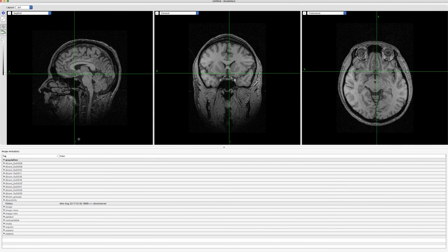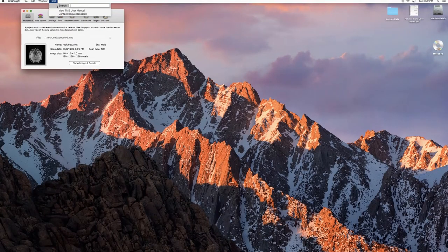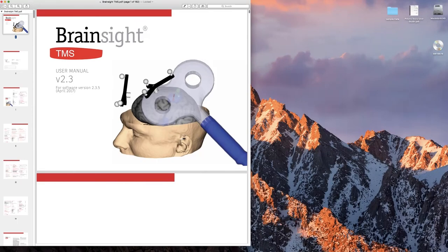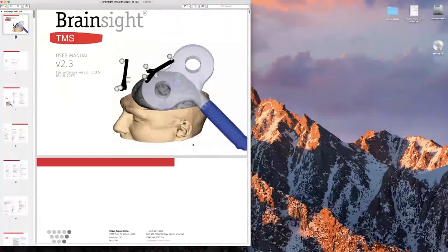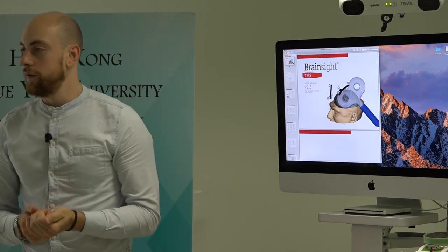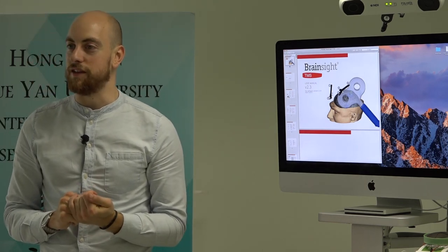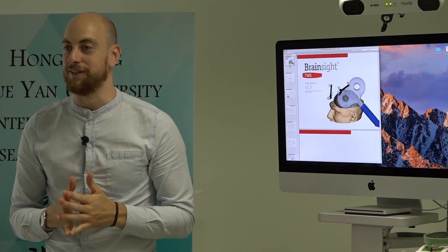But, yeah, you can upload any DICOM, NIFTI, MINC, and there's another one that you can upload as well that takes the main four formats. Everything in terms of that is all available in the user manual there. It'll tell you all the formats and stuff that it'll let you upload. Any more questions? If there's anything that I've not covered, that you want me to try and run, I'll do it to the best of my ability.